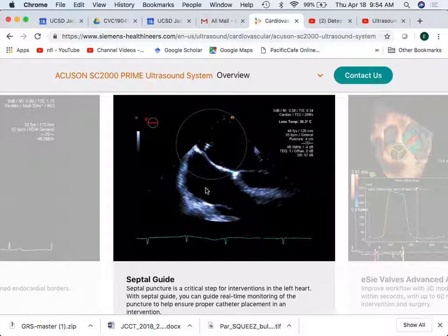The left circulatory system, if you want to get in the left ventricle, the left atrium, whatever, if you come on an arterial pathway, you're working in a high pressure system. If you come from a venous pathway, you're working in a low pressure system. So oftentimes they come through the right side.